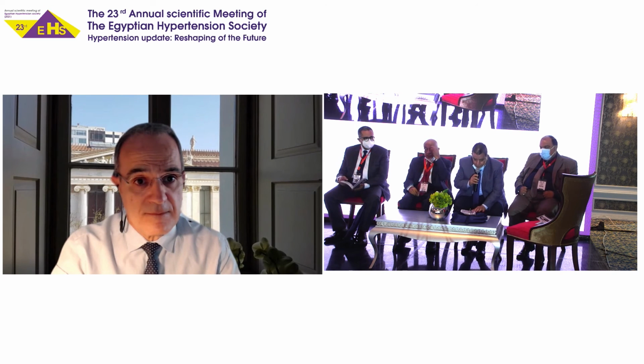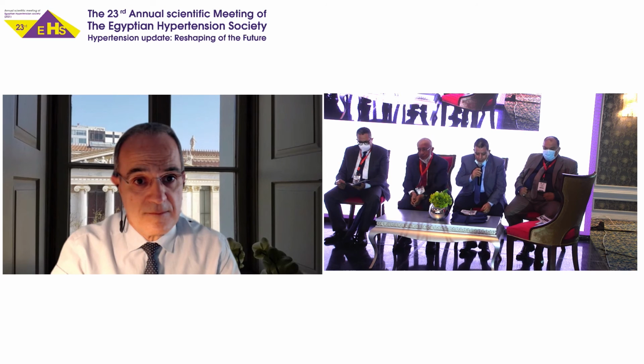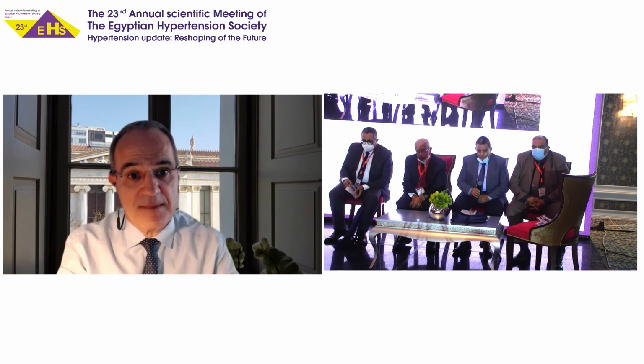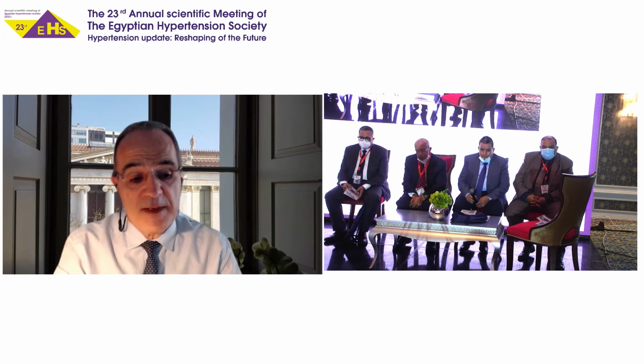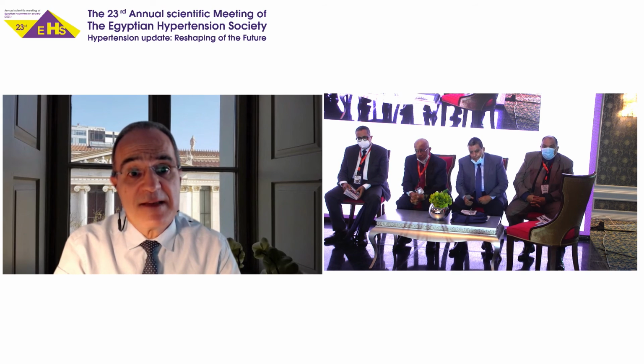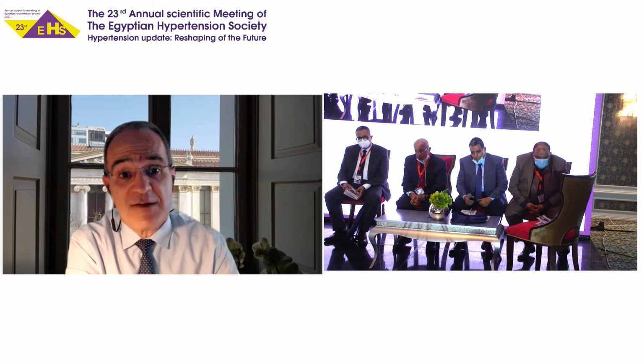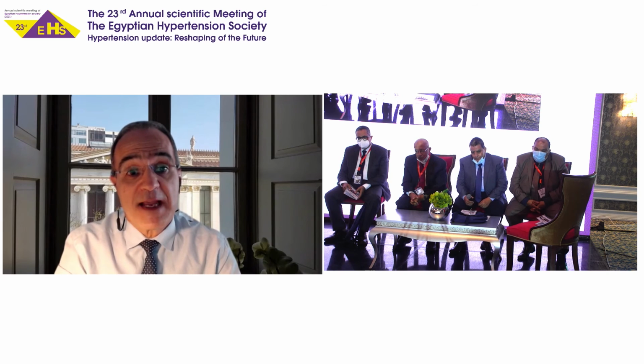Thank you very much for your elegant presentation. My question is, can we rely on automated wrist devices for follow-up for a long period of time? You mentioned wrist devices, not arm devices. Yes, wrist devices. So if we are talking about wrist devices, these devices are of two types. One is the wrist cuff devices, so they have a cuff that inflates as with the arm devices. And we also have the cuffless devices without the cuff.